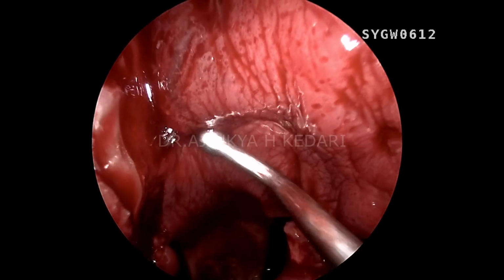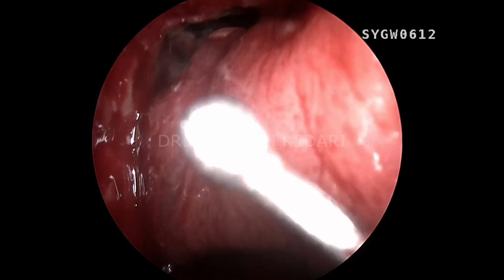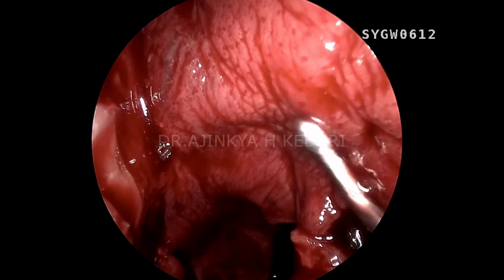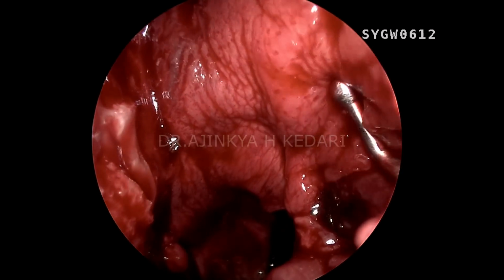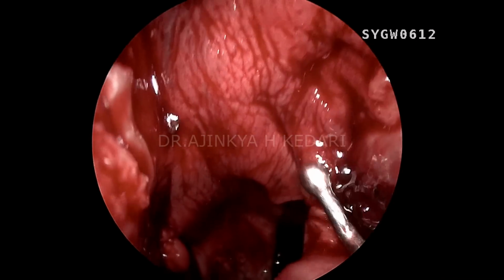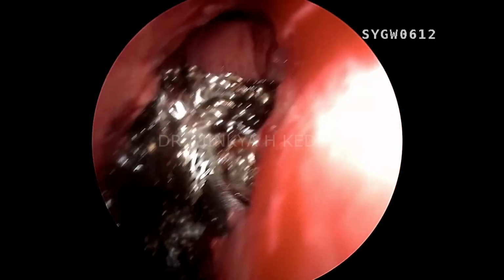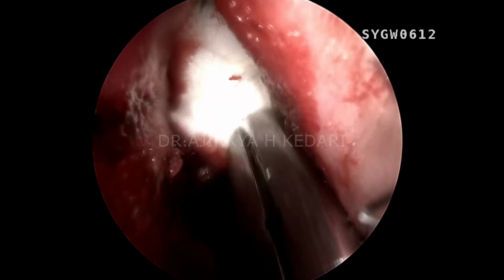You can see that's the Hadad flap completely spread out, and that's the frontal sinus opening up there, completely patent. That's the Hadad flap kept very normally over the cribriform plate, olfactory neuroepithelium, the primary and the secondary CSF leak site.